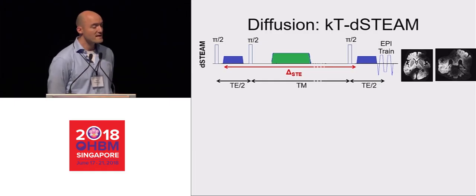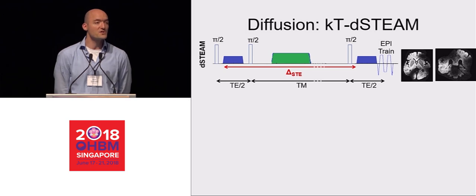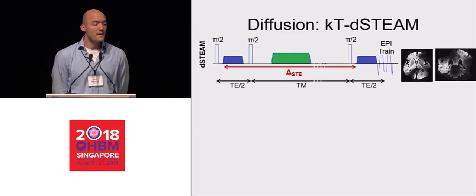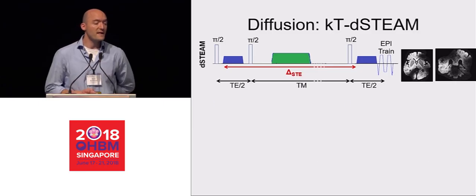Now, the final drawback that you have at very high fields of 9.4 is that STEAM sequences, as also spin echo sequences, will suffer from the inhomogeneity of the field, so the inhomogeneity of the flip angle over very large samples. And you see that indicated here on the right for the whole human brain, post-mortem. And you see very large fields of dropouts, very big black holes in the brain.